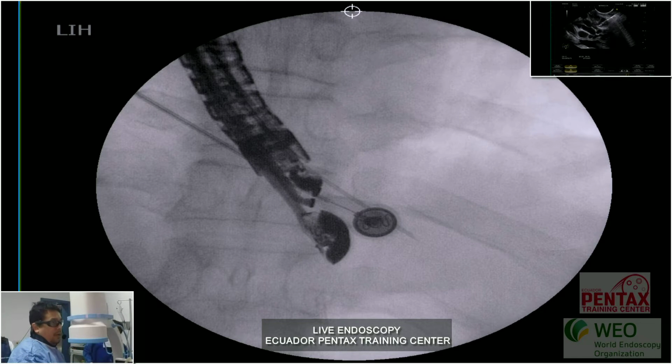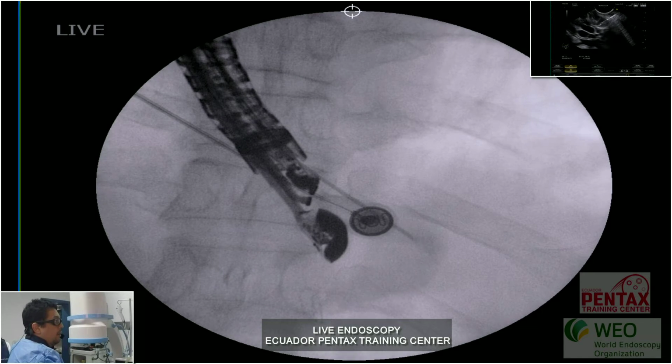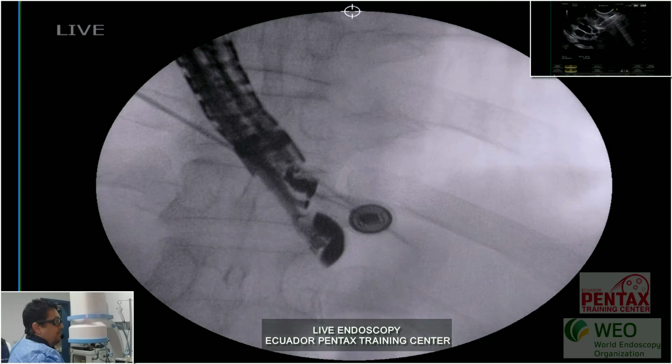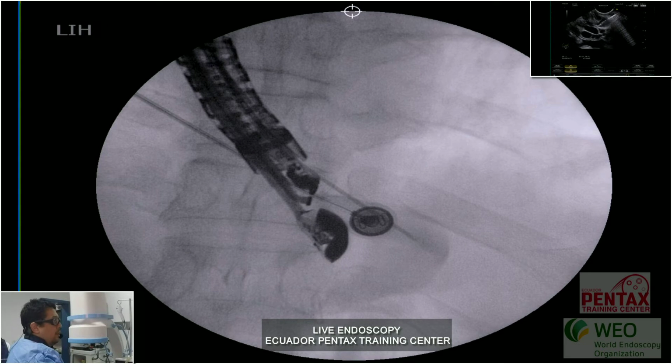So now I have the view of the X-ray and the US. Esto es contraste o agua? So now we can also use contrast to see by X-ray if we are in a good area. You can see here, this is the feeding vessel because the trajectory of the contrast is going down.